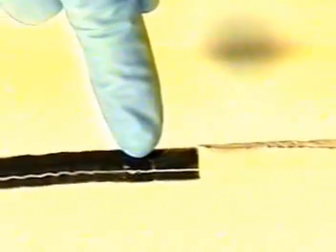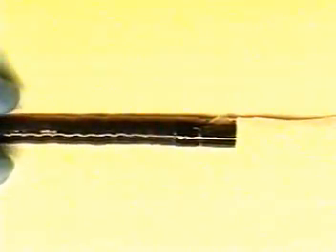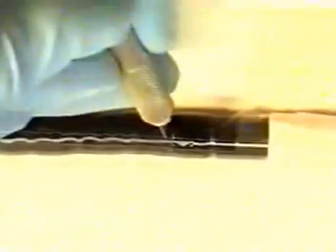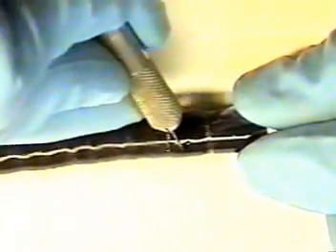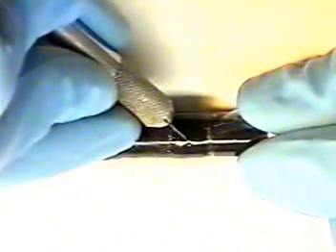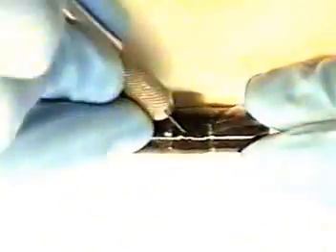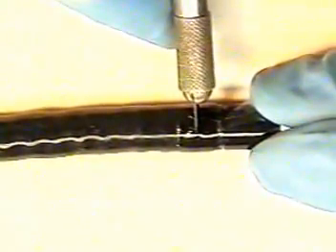Now we have the glue binding, Scotch tape, and a protective paper towel. We can now proceed to cut into the second proximal glue joint. Again, with your X-Acto knife, cut halfway diagonally into the second glue joint. You'll be cutting halfway into this glue joint diagonally.